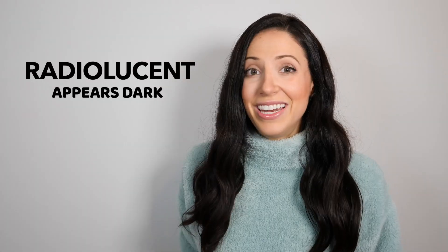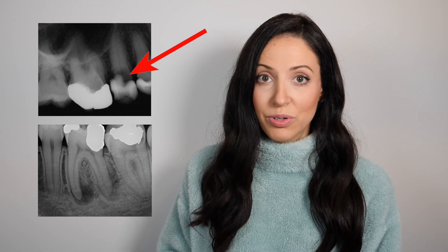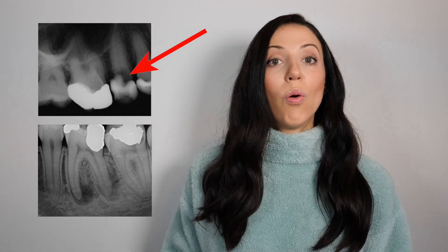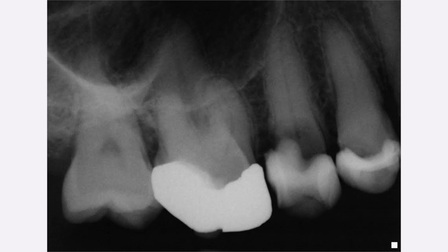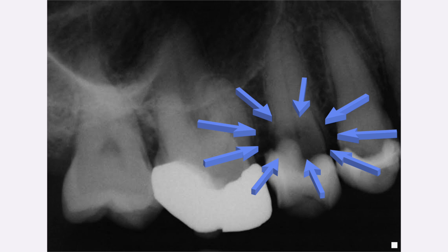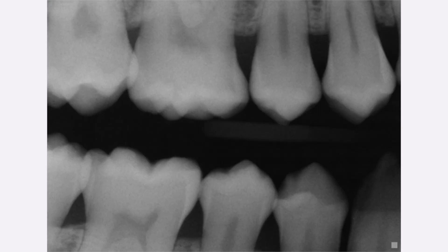But if your dentist or dental hygienist is talking about something that is abnormal — let's start with radiolucency — then it's most likely a cavity, also known as decay, or an infection. Here is an example of a radiolucency of a super bombed-out tooth. This tooth has so much decay it might be able to be saved through a root canal, but honestly this one might need to be extracted.